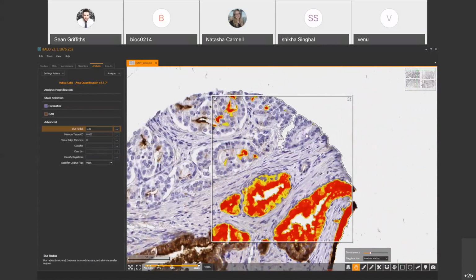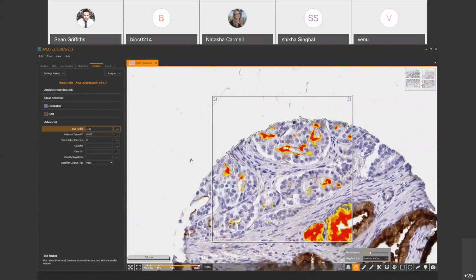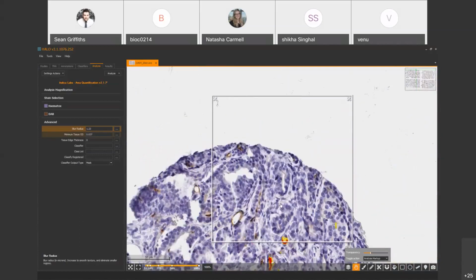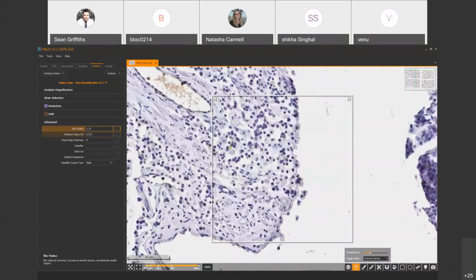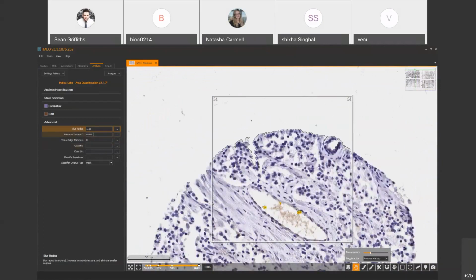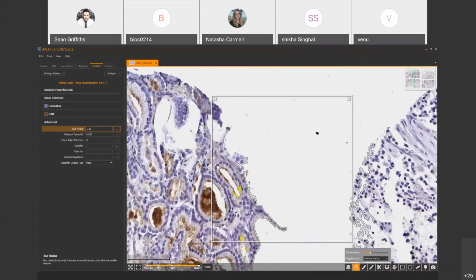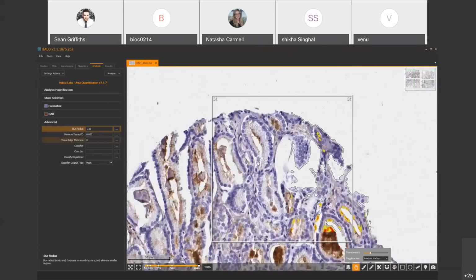The other thing which you'll notice is that you see here there's a black outline around the TMA core. That's because of something called minimum tissue edge optical density. So most of the bright field modules operate this parameter, and it's effectively telling Halo what is the glass slide and what is your tissue. The only image format I'd be a little bit wary of this at default settings is the Zeiss CZI format, which tends to have a little bit of a darker background, and you'll need to adjust this, usually adjust it upwards. Most other formats, you can leave it on the standard setting.